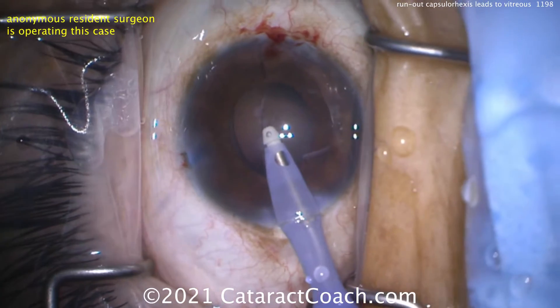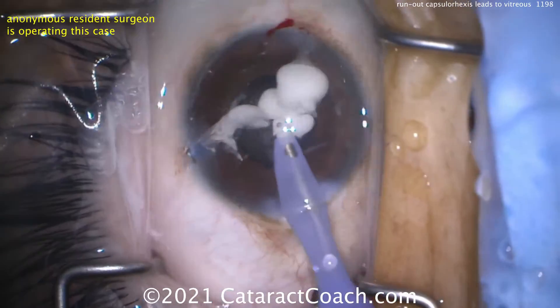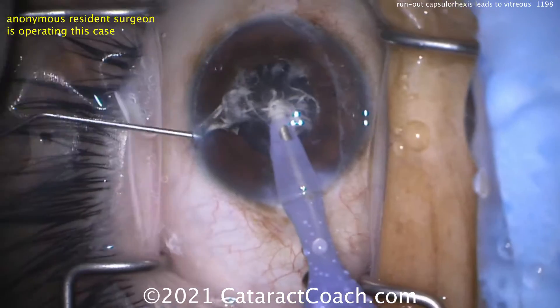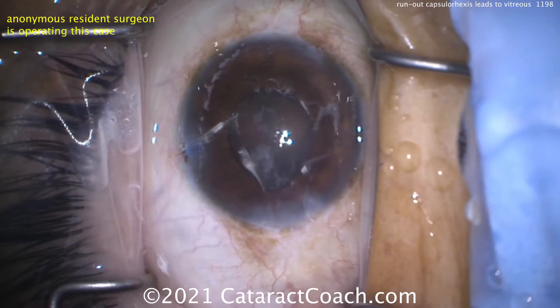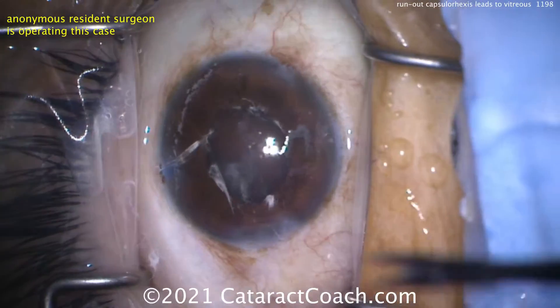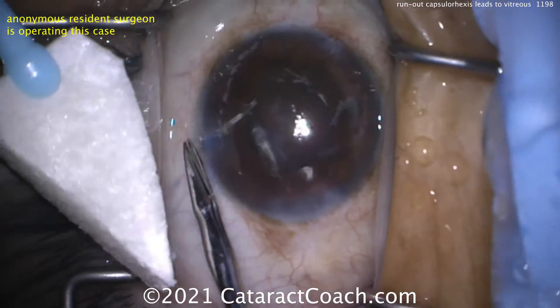Now is a great time to stain with triamcinolone to see if there's vitreous in the anterior chamber. Inject some triamcinolone and swirl it around with the infusion. And yes — there certainly is vitreous present. By coming out of the eye like that, you let it prolapse right out of the incision — it shouldn't have come out like that. You can grossly cut those very large strands while we set up the anterior vitrector.